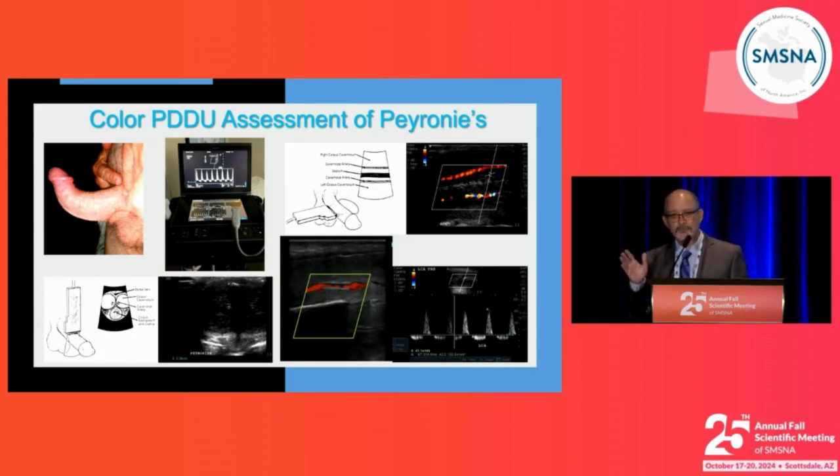So the assessment is pretty straightforward. Injection, duplex Doppler ultrasound done at 5 to 10 minutes after injection, duplex Doppler ultrasound done after a period of visual sexual stimulation. If the patient can't tell you that he's getting the kind of erections he normally gets at home, then you redose. I've recently had to switch to low-strength trimix for a lot of my Medicare patients because there is a restriction, apparently, of Medicare reimbursing for prostaglandin E1 injections being given in the office. So that's a caveat to you, especially if you're having patients sign Medicare waivers. They get a bill for $400 for a simple PGE injection, which is silly.